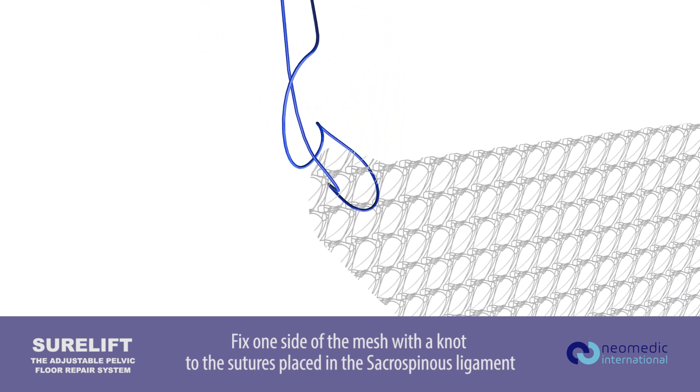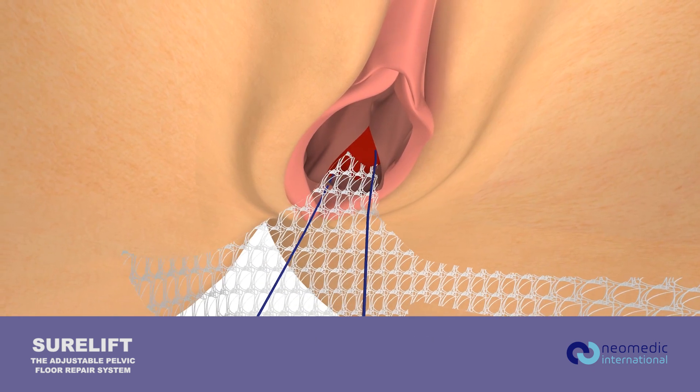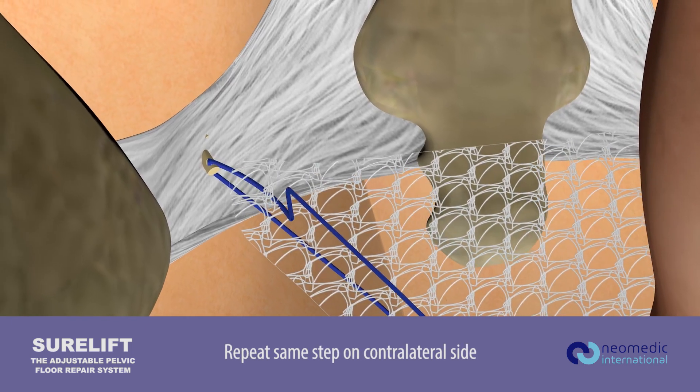Fix one side of the mesh with a knot to the sutures placed in the sacrospinous ligament. Insert the mesh towards the anchor with the pulley system. Repeat the same steps on the contralateral side.